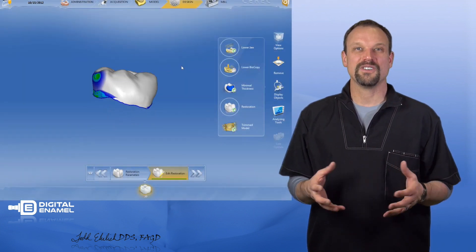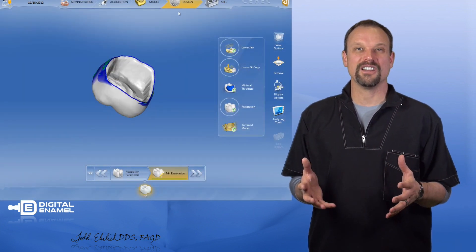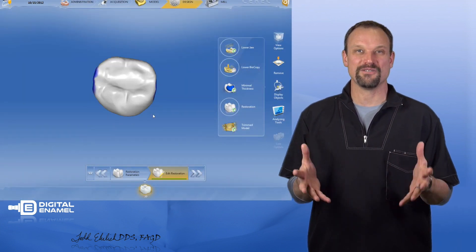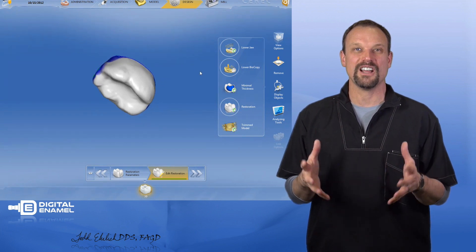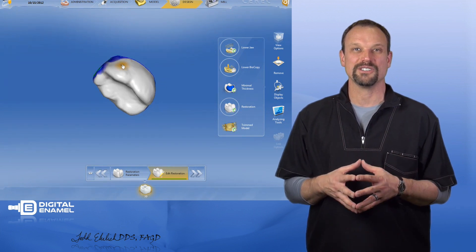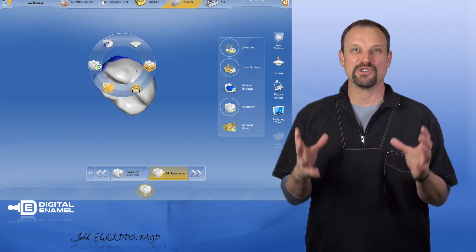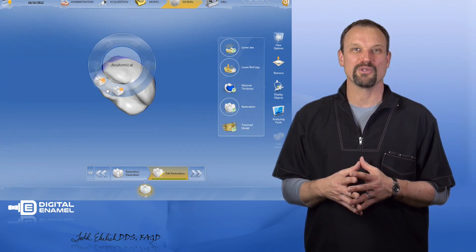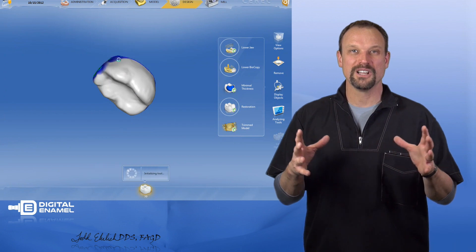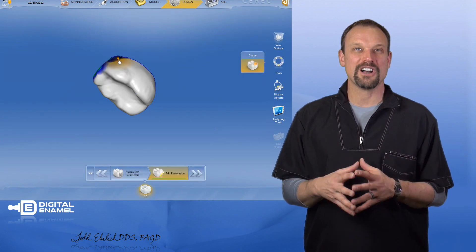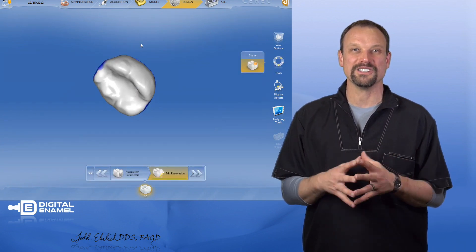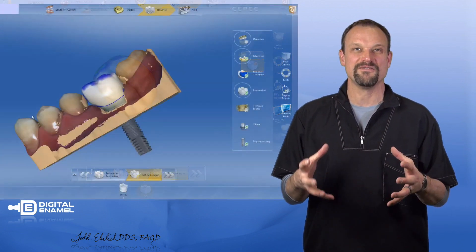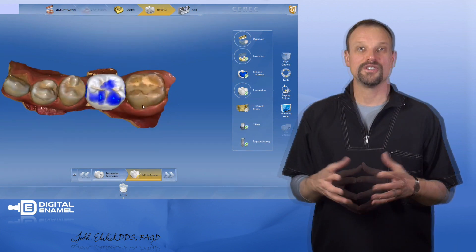The next phase is the design phase. This is the fun part. This is where you get to design that restoration. This is where you have control over your embrasure shapes, interproximal contacts, occlusion, all of those things. This is basically the video game part of it.